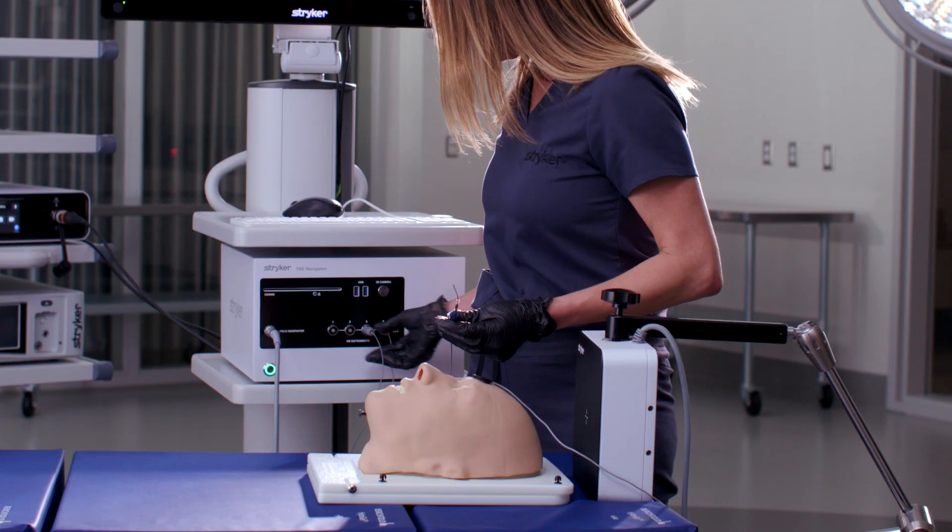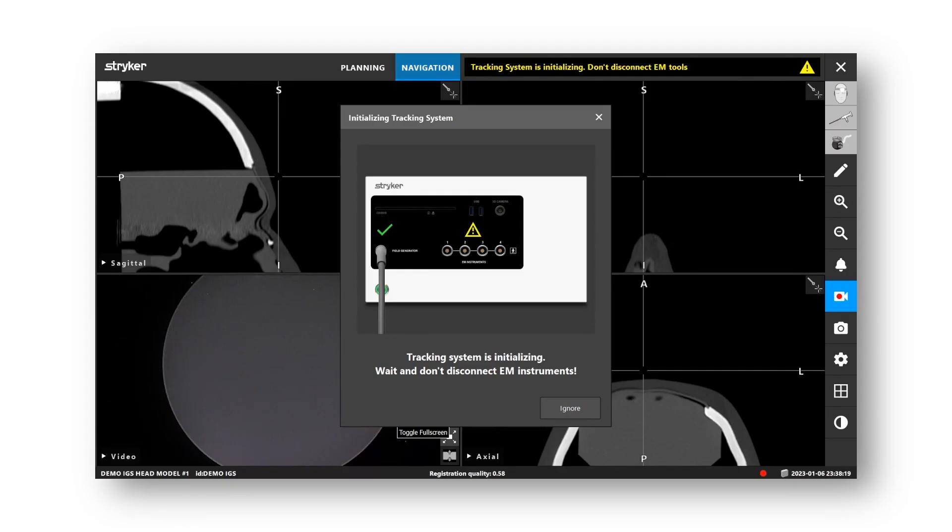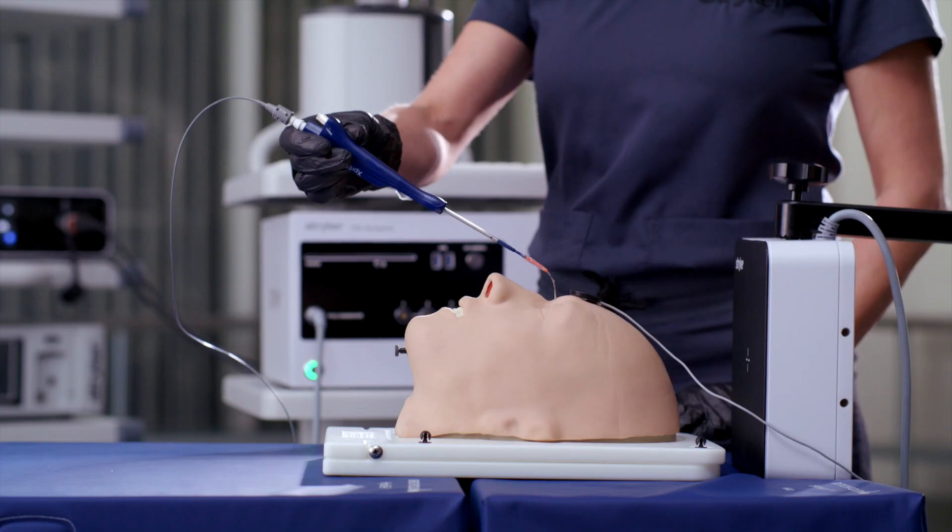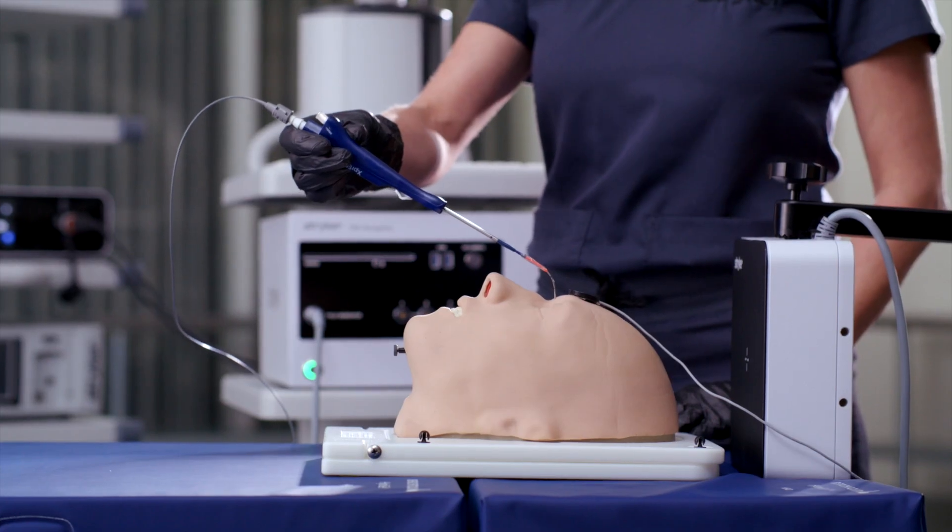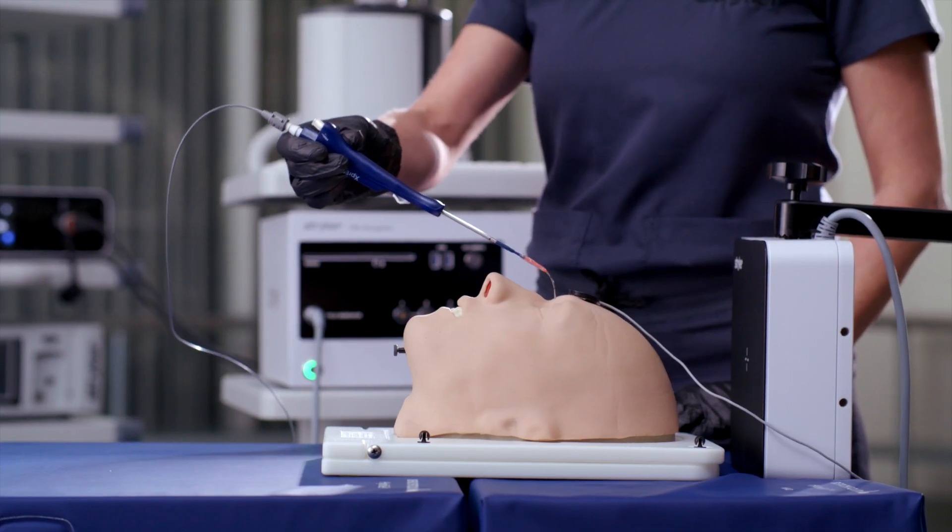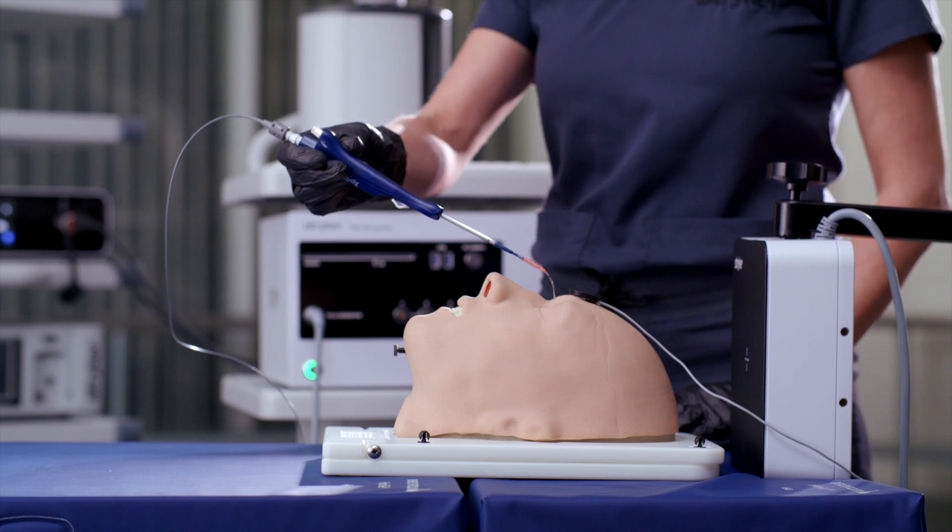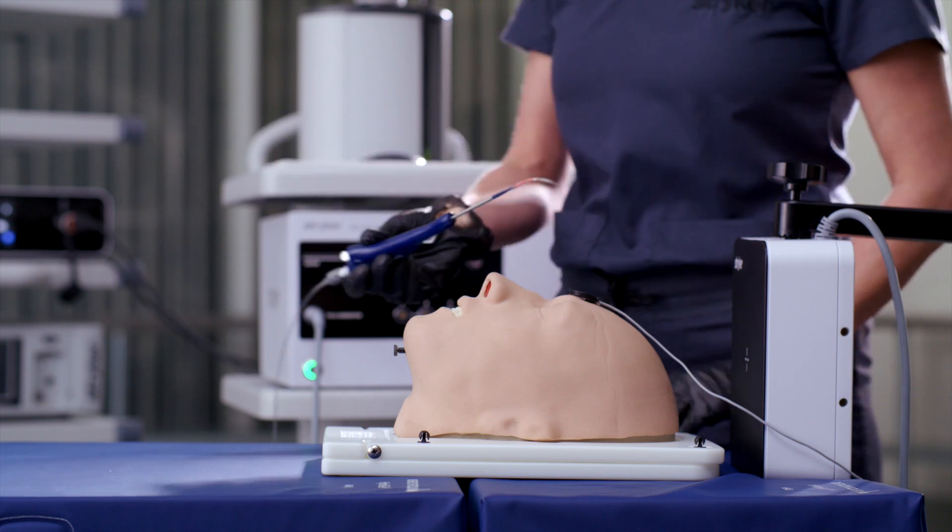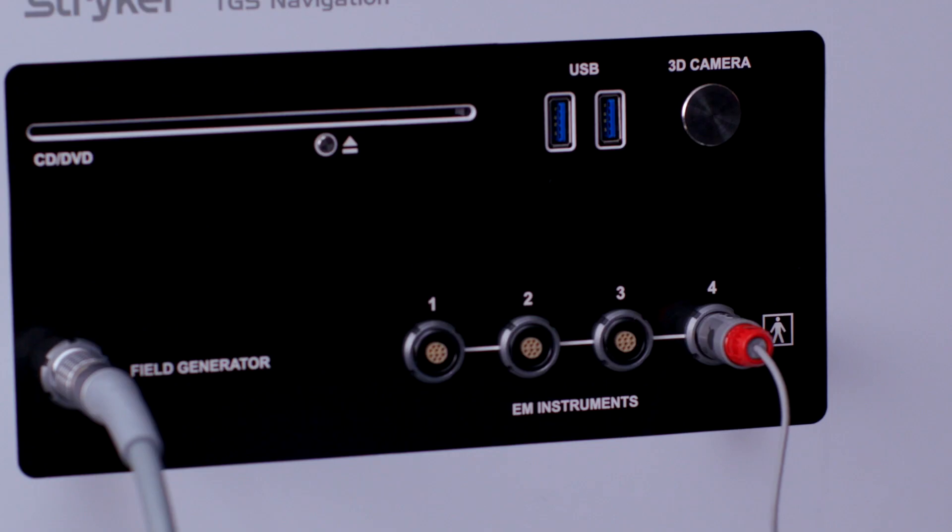The TGS guide wire, precision pointer, and suction tubes are plug and play, so no calibration process is required, and they can be used immediately after they are plugged into the system.